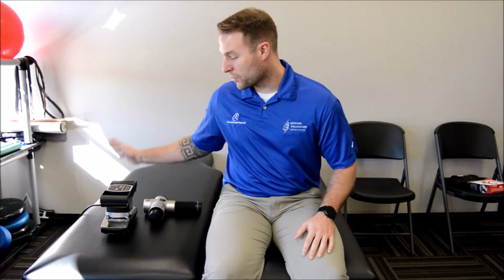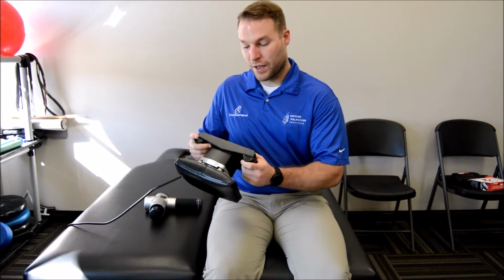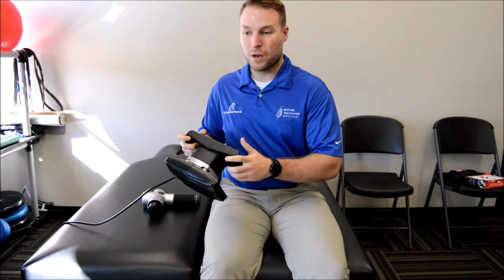Okay, the second thing we use quite a bit of is we have these massage tools, these massage machines we like to use. So the first one is just kind of this vibration plate massage tool. So what this is going to do is when we turn this on, this big plate starts to shake pretty good, and we can crank the speed up or down to whatever's most comfortable. But what we like to do this for is if you have a really painful, tight area, we can set this massage plate on here, and that shaking, it's kind of like if you hit your thumb with a hammer and you start to rub it, that sensation of rubbing it kind of makes the pain go away. This does the same thing. It kind of shakes up that area and decreases the pain, but that shaking will also cause that muscle spasm, that tight muscle, to kind of relax a little bit.